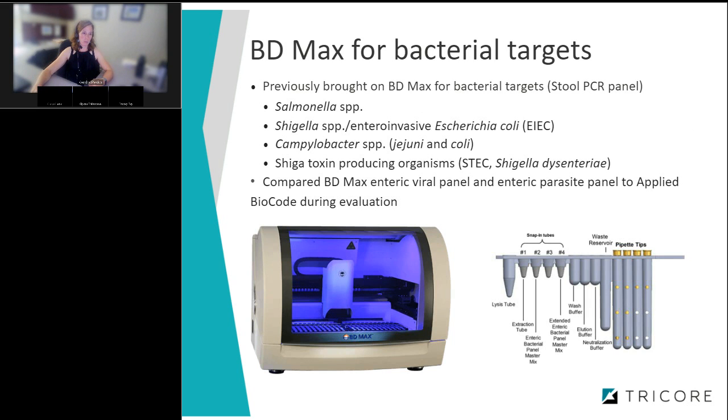The BD Max is a smaller platform that uses cartridge-based extraction and then loads the extract onto a card for PCR to occur. We had previously brought on the BD Max for bacterial targets and currently use it to test for Salmonella, Shigella, Campylobacter, and Shiga toxin-producing organisms.